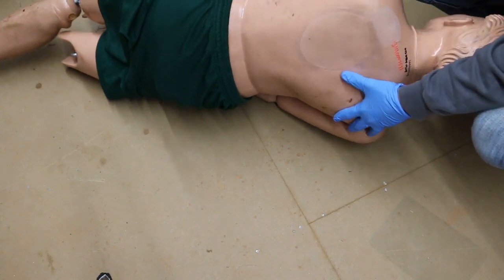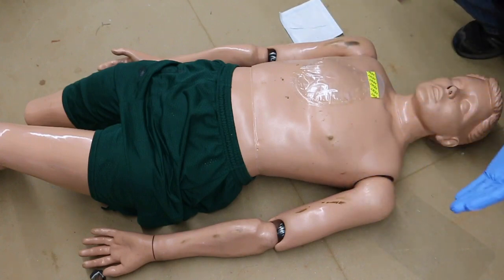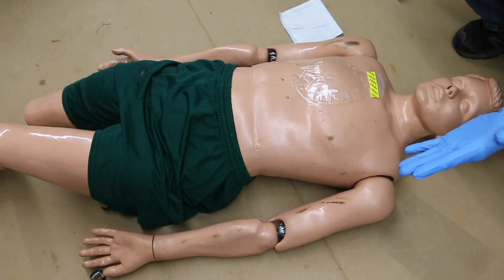Secure it. Log roll him back over. And he's good to go.